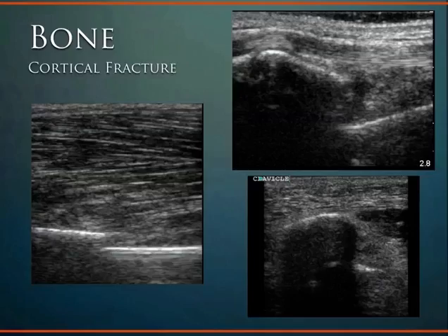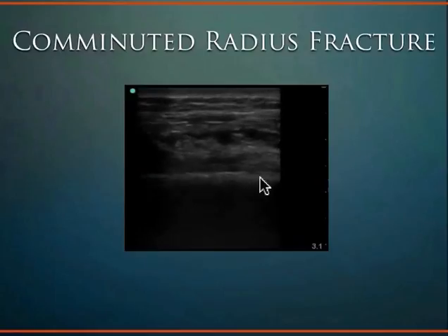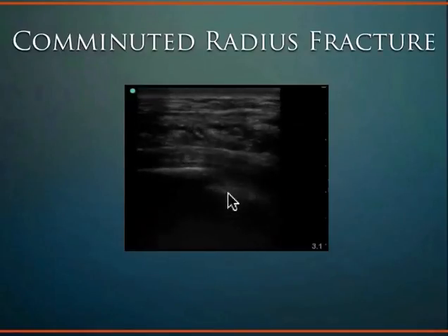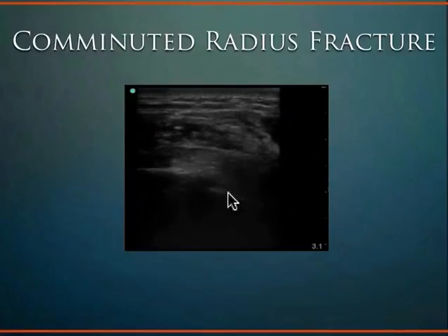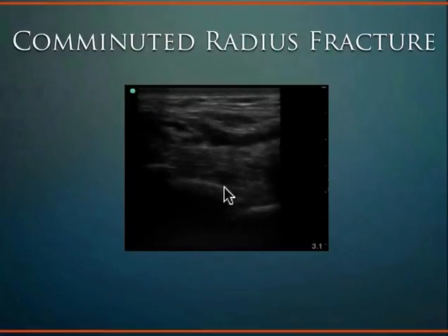When you get a good sense of what that looks like, and then you look at fractures and pathology, it becomes quite obvious, where you have that discontinuity and what people refer to as step off. It'd be nice if they were all this obvious. They're not always all that obvious when you're looking at that top right picture. And then this distal clavicle fracture, very common step off type appearance and displacement of the bony fragments. This is a comminuted radius fracture. You'll see the continuity of the cortex line here, and then eventually you'll come into play here where you're shadowing, step off to this cortex line here, and then as we move further along, you'll see another step off down to here. So there are basically two fracture lines, comminuted, multiple fracture locations, again seen very exquisitely with the ultrasound.